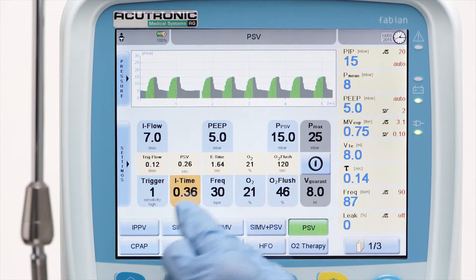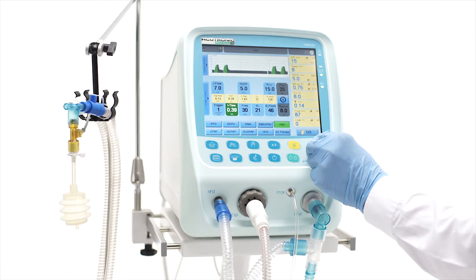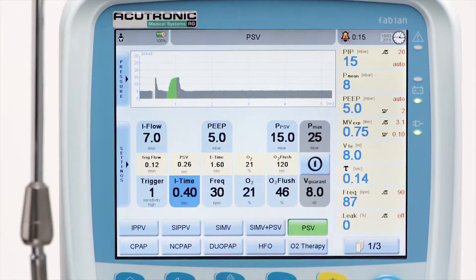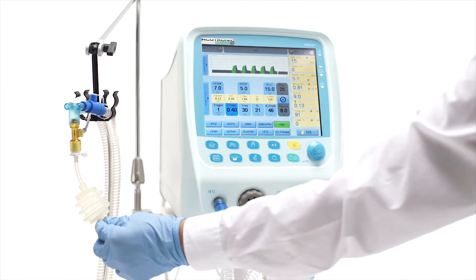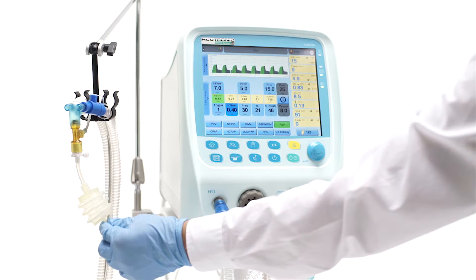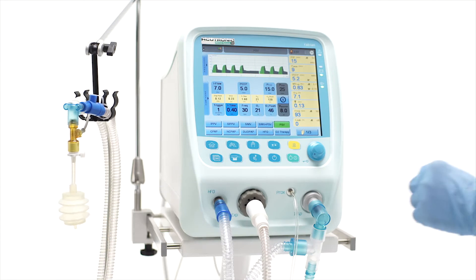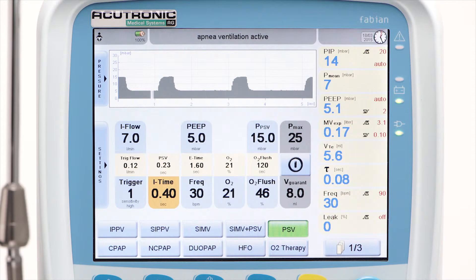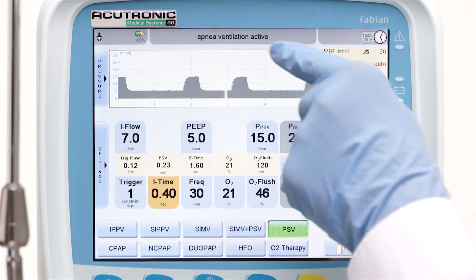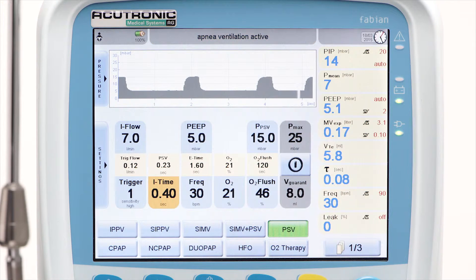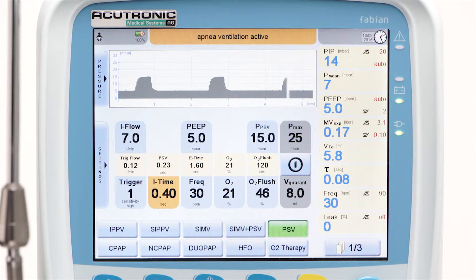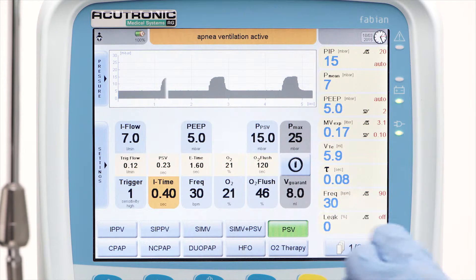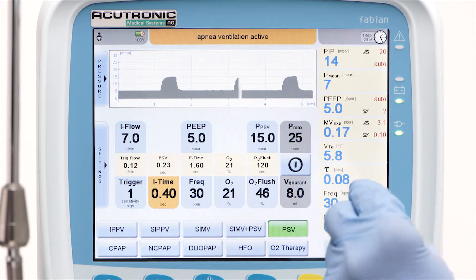The i-time orange button has a double function here. It represents the maximum i-time for the PSV breath, in case the flow termination criteria are not met, and also represents the inspiratory time of backup strokes in case of apnea ventilation. In case of apnea, the ventilator starts the backup apnea ventilation mode. The delay for the onset of the backup ventilation is set in the alarm settings menu with the apnea time in seconds.